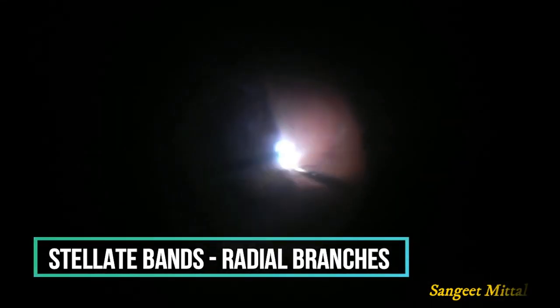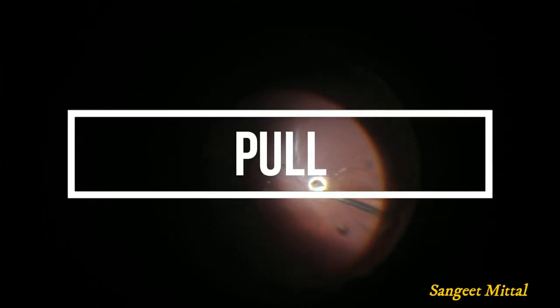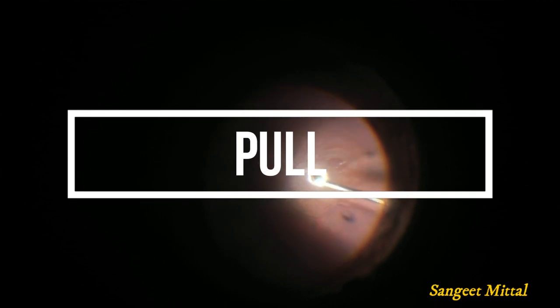Similarly, stellate bands with small radial branches can be removed by pulling at the epicenter of the band. Small radial bands associated with retinal breaks can be removed by pulling the band away from the retina.